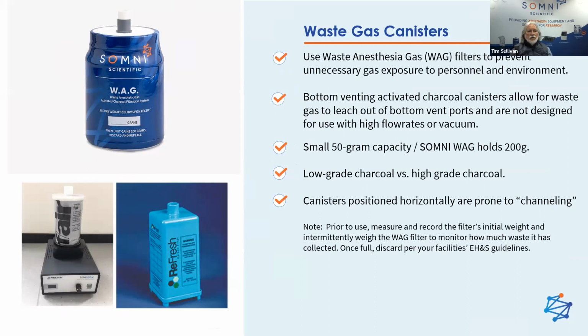The problem is anesthetic agent is heavier than air, and it just continues to leach out the bottom even after you collect it. The other problem that we see is the user will set these filters on their side because you can't stand them up or you block the ports. And then it just channels across the top, so the charcoal's not really accomplishing anything.